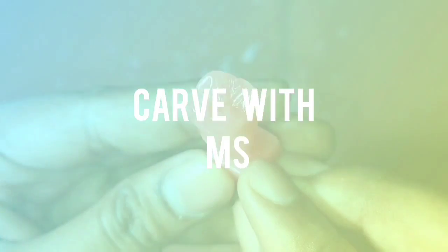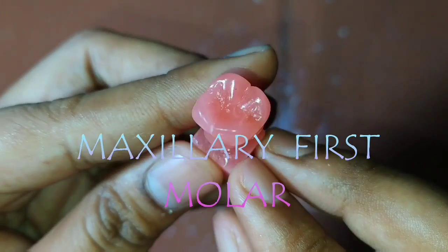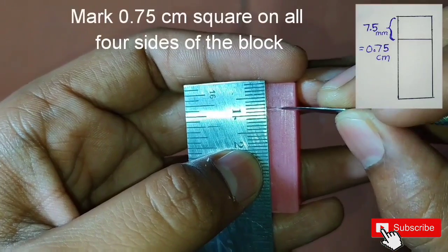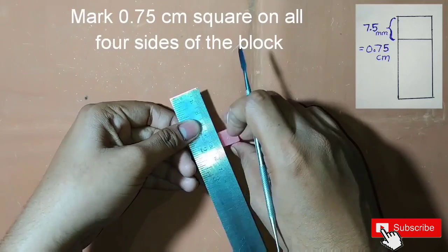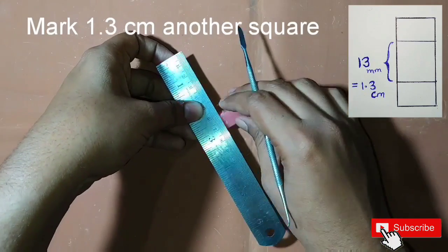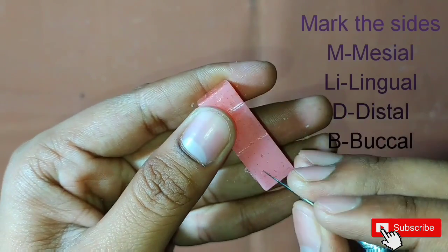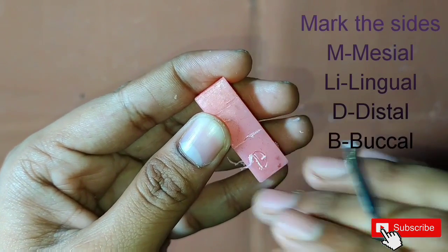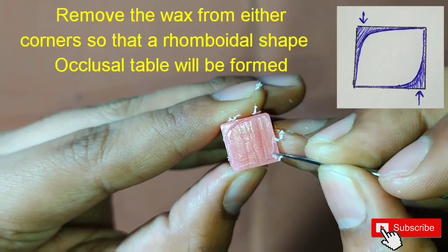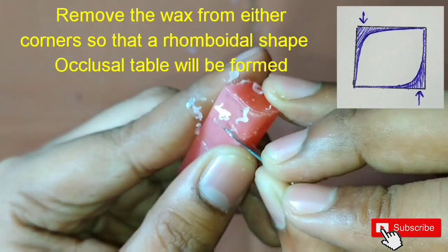Hello everybody, welcome back to my YouTube channel. Today we are going to do the carving of the maxillary first molar. First of all, mark a 0.75 centimeter square on all four sides of the block, then mark a 1.3 centimeter square on all four sides of the block. Mark the sides as mesial, lingual, distal, and buccal. The crown of the maxillary first molar is rhomboidal shape, so on the occlusal table we will mark a rhomboidal shape and start removing the wax from the two opposite corners.